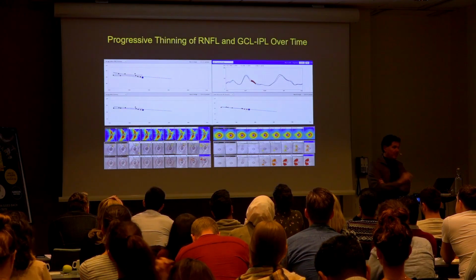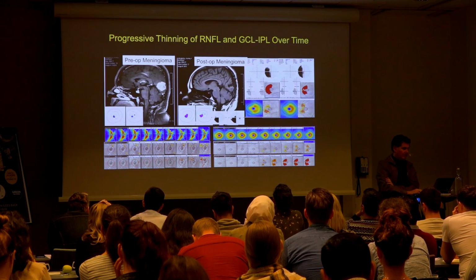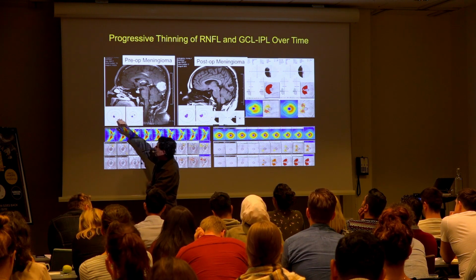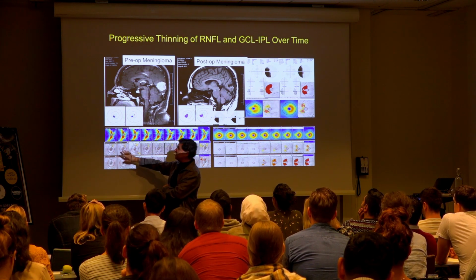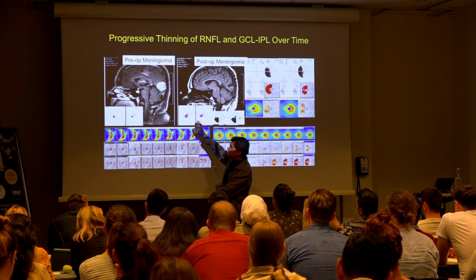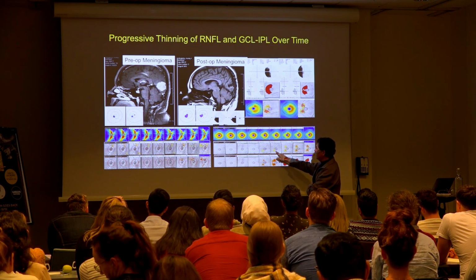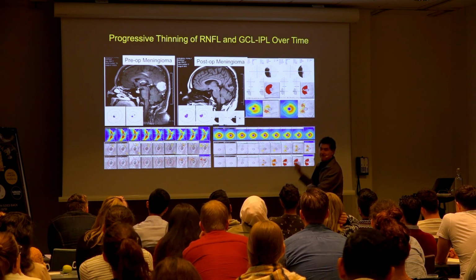And this was a patient that I've been following at Iowa who, let me show you, I'm going to go back to this. She had an occipital meningioma, and this was her pre-resection homonymous field defect, and she had no prior ganglion cell layer thinning due to the lesion. But she had it resected, and the scotoma was bigger, right? And it came in closer to fixation. And I've been following her in terms of her ganglion cell layer. What was interesting is you can see that at about 16 months after the resection, she's starting to get dieback into the retina.